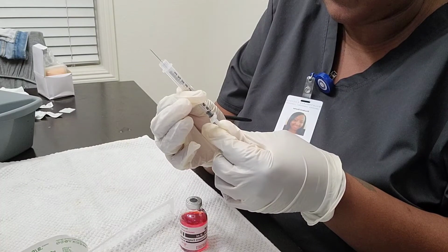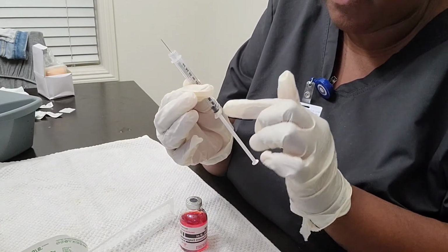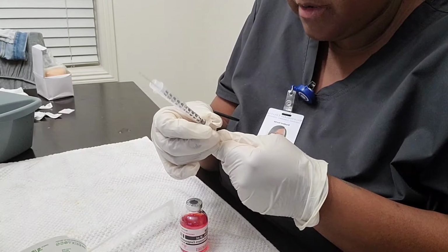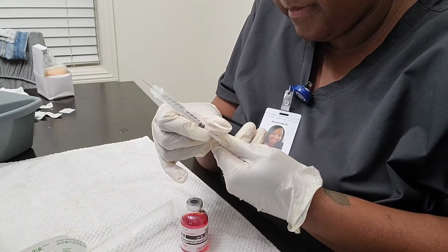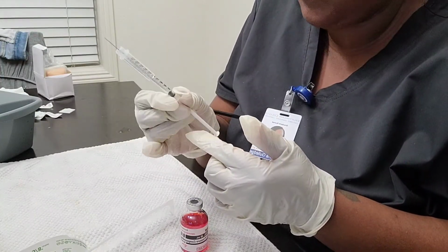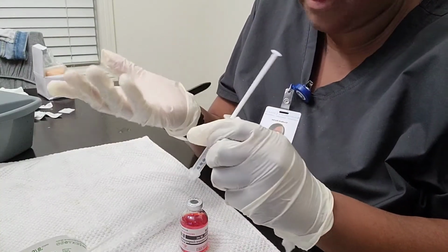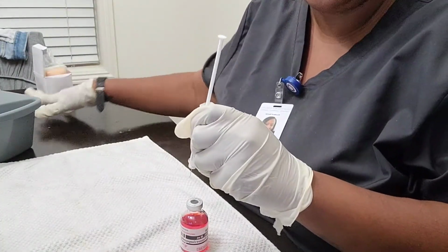And I just kind of went down to make it seem like it's 1.5. Okay, so since this is a 1.0 ml, I'm just going to go down like it's 1.5. So I went a little bit down, but I'm just kind of improvising right about now.